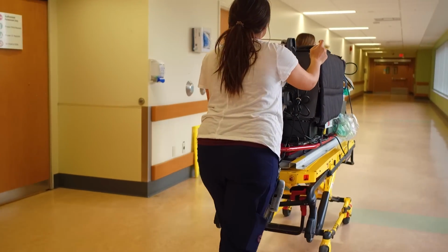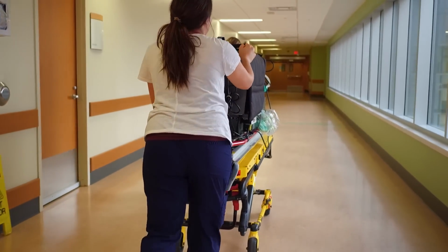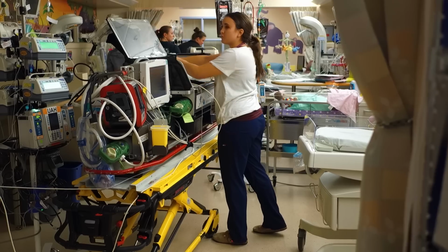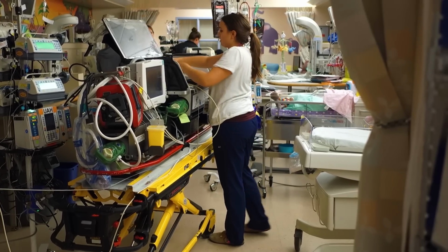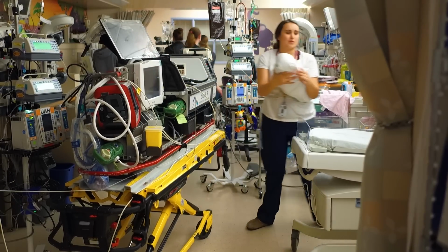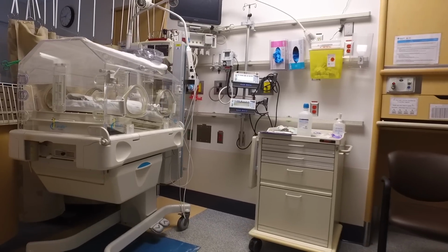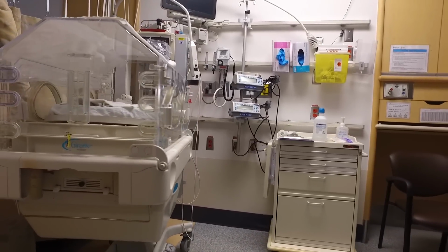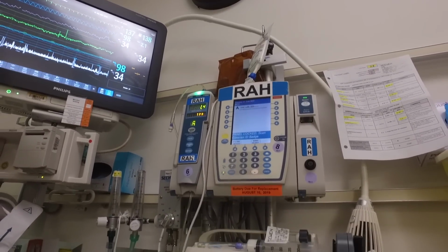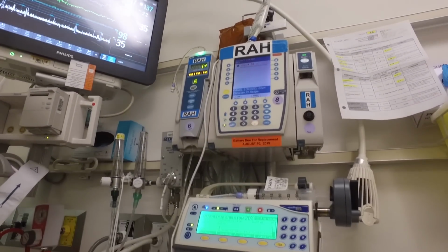You will see many NICU team members preparing for your baby's admission. If your baby is not already in an incubator, then your baby will be moved to one. These are houses for babies that provide warmth and humidity. They also shield baby from light and noise. You may hear alarms as the monitors are switched over to the bedside monitors. These are often loud, but are usually not serious.